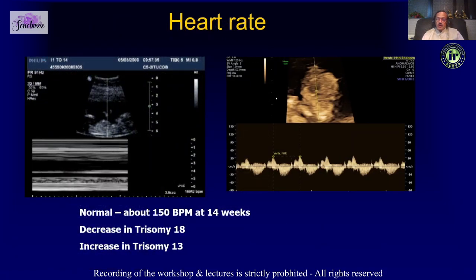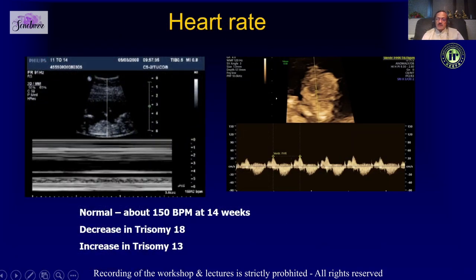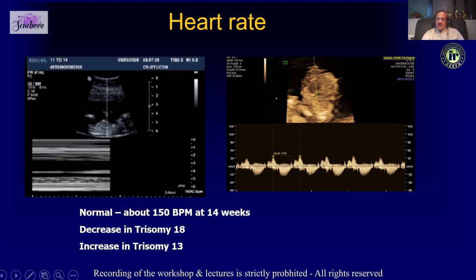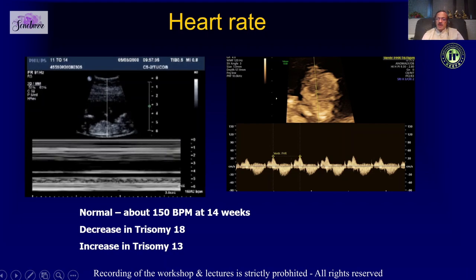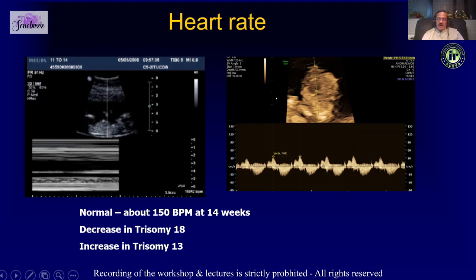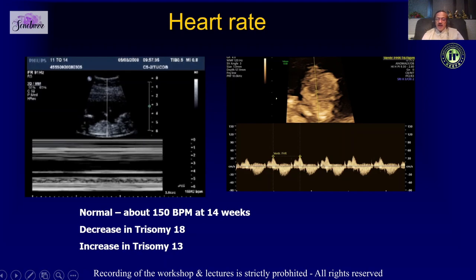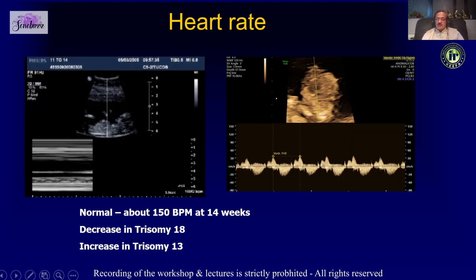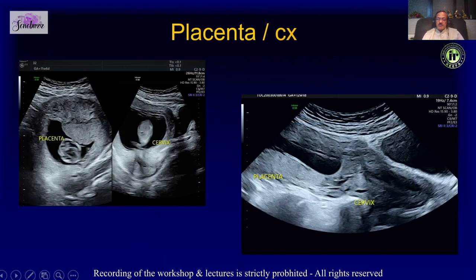We look at heart rate — typically in our center we assess the tricuspid valve at the same time as we measure the heart rate. Heart rate can be abnormal in certain trisomies. We also look at the placenta; most of the time the placenta will be covering the os.